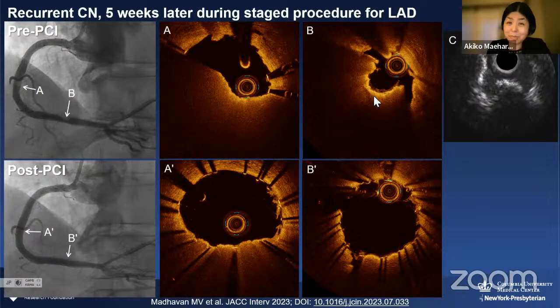But I had a little doubt. Is this really the calcified nodule or could it be red cell thrombus? Then we took the IVUS and confirmed this is really the calcified nodule. And we decided to put in more stent. And you see again nice stent expansion. But again, you start seeing there is already a reprotrusion of the calcified nodule. This is how the mechanism of stent failure of the calcified nodule looks, especially the eruptive one. Afterwards, this patient was okay and is now doing well.